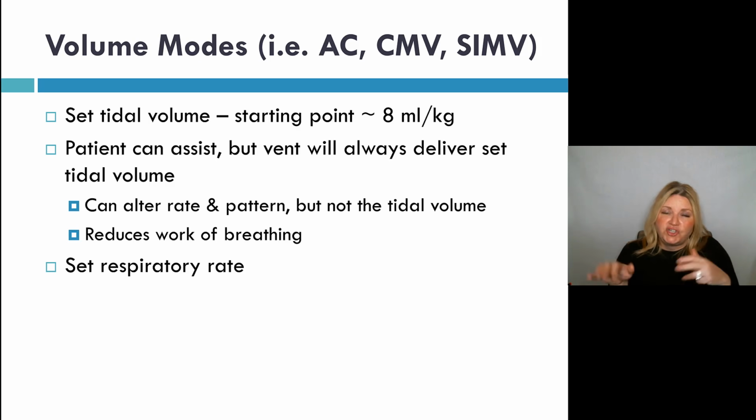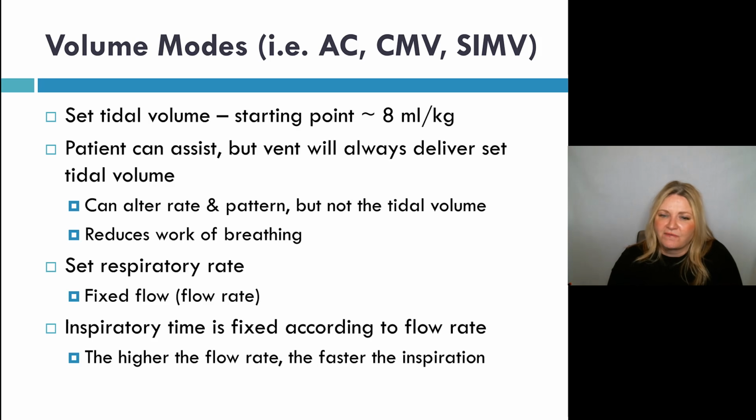The rate is basically just a minimum breath rate that you want that patient to get. So let's say we choose 12. So that means is it 5 seconds? Am I doing my math right? So every 5 seconds, your patient will get a breath. But if they want to breathe over that, they can, which is a really easy thing for the patient to do.